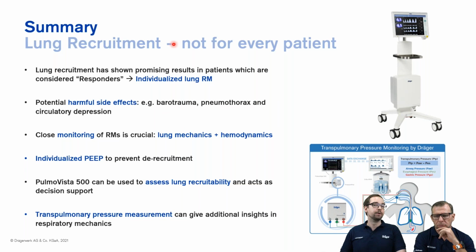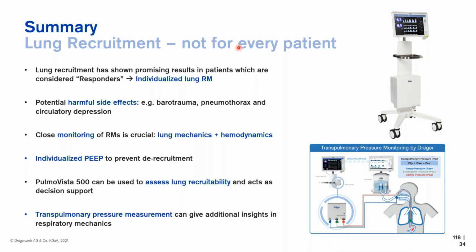No. Certainly not in the OR. We certainly need to consider it, I think, more often in the OR than we probably currently do in general practice, but it's certainly not for every patient. And we have some really great tools on the screen of modern anesthesia devices and patient monitoring to help assist with that decision-making, which is key.